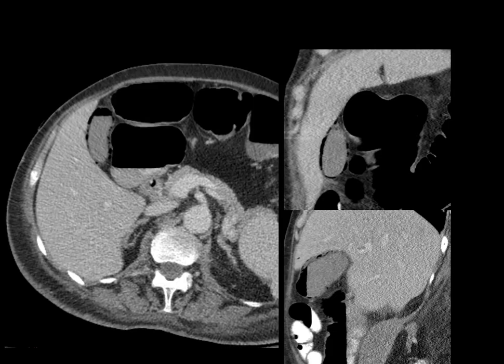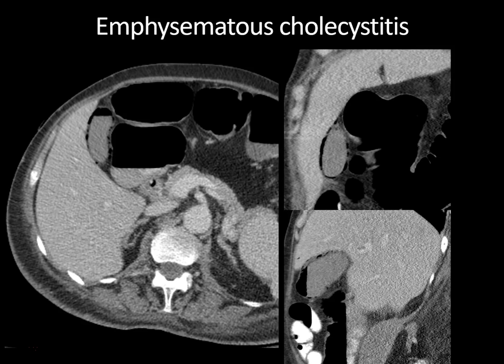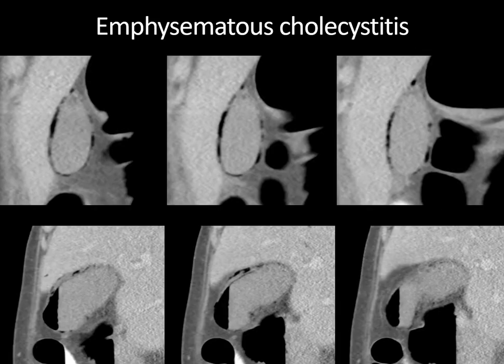The patient also had a CT scan of the abdomen, and you can see that there is indeed gas in the wall of the gallbladder on this axial image. We can also see it on this coronal image and here on the sagittal image. So whenever you have gas in the gallbladder wall, that's diagnostic of emphysematous cholecystitis. These zoomed-in coronal and sagittally formatted images of the CT scan show how lung windows can help to bring out the gas within the gallbladder wall very nicely. We also have some gas in the lumen, but that's not specific for the diagnosis of emphysematous cholecystitis.